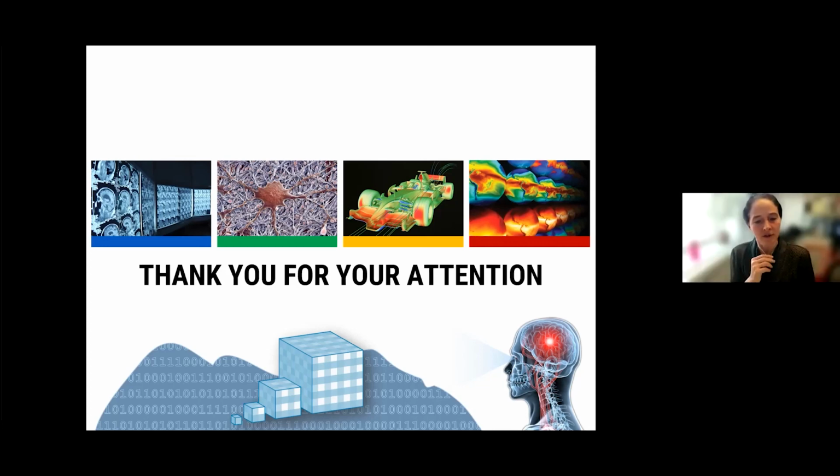There's another question concerning the MIP. How do you decide on the best ray direction to collect the maximum intensity? So basically, what is typically done is you're really looking at the ray direction from the point of view of your virtual camera.